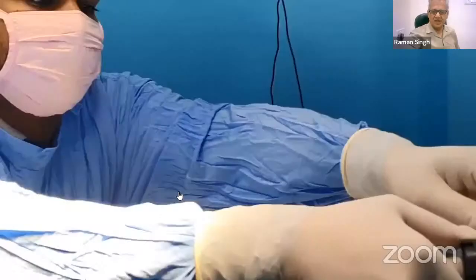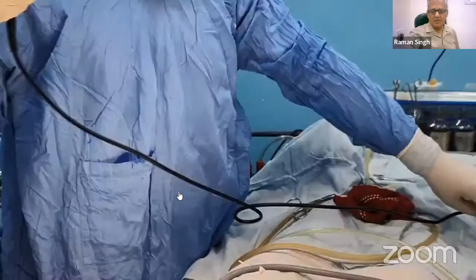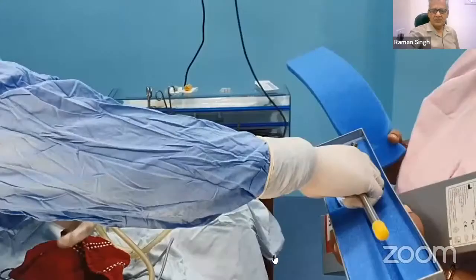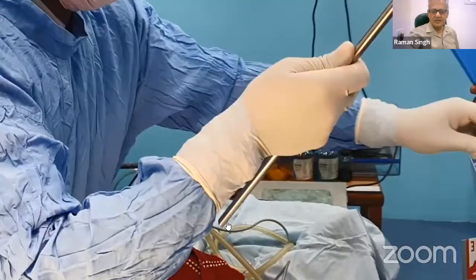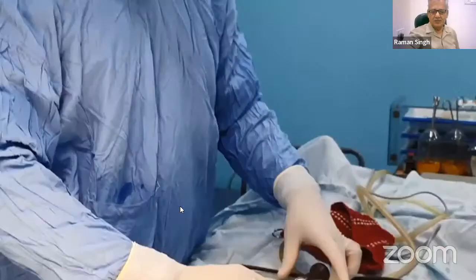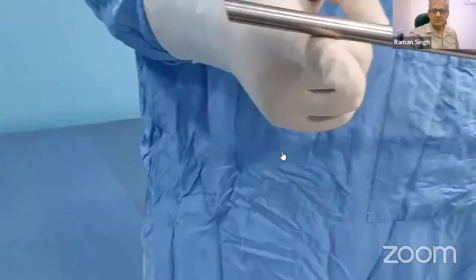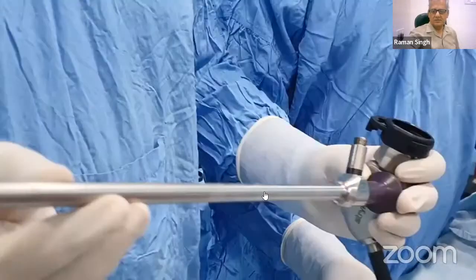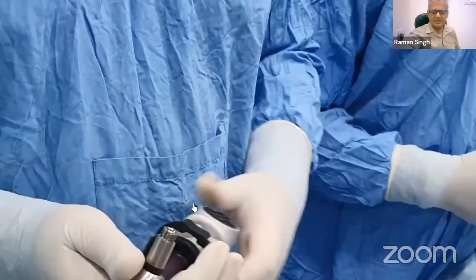Before going to surgery, you should prepare all the instruments and check whether they are working properly or not. So after getting all connections ready and getting all the instruments ready over the operation table, this is the telescope attached with the head, as I said.